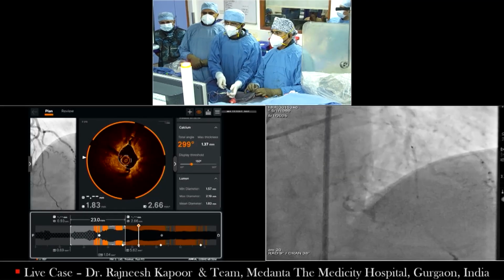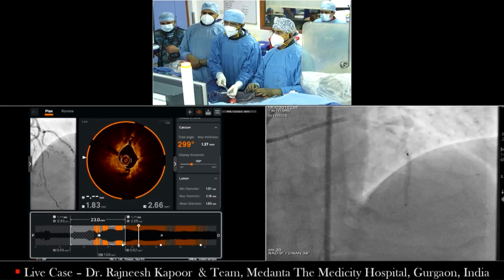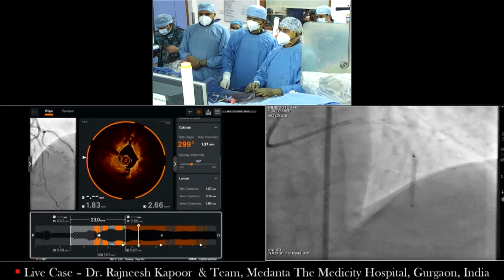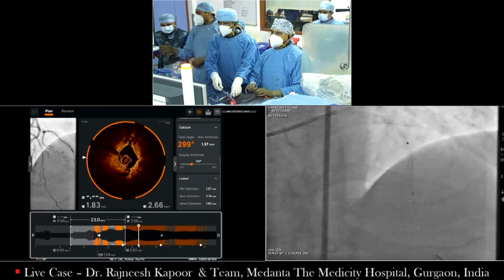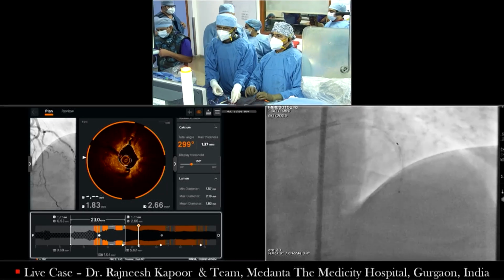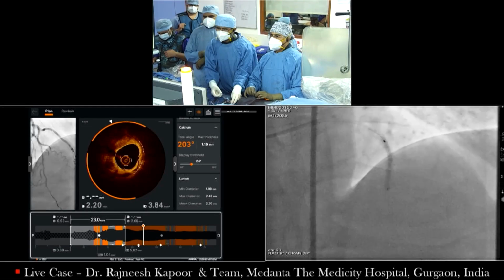Okay, go. 6, 7, 8, 10, 12. Down. 2.58, give it. I think this was a beautiful demonstration of being patient and doing the atherectomy completely and then modifying. So you really showed that. Yeah. 6, 8, 10, 12. 14 down.